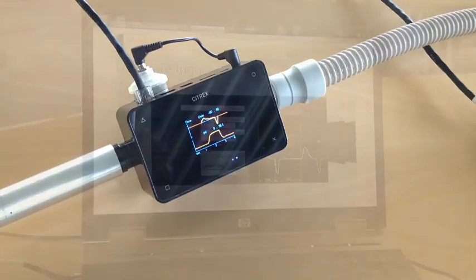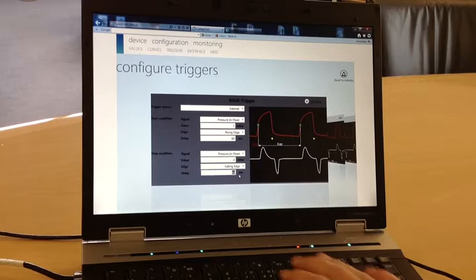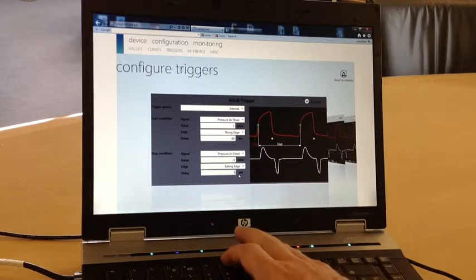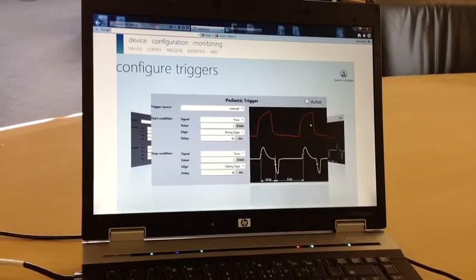Citrex web server offers visual assistance for setting triggers for volume measurement. You can now define start and stop conditions in an easier way, and get instant visual feedback about your choice.